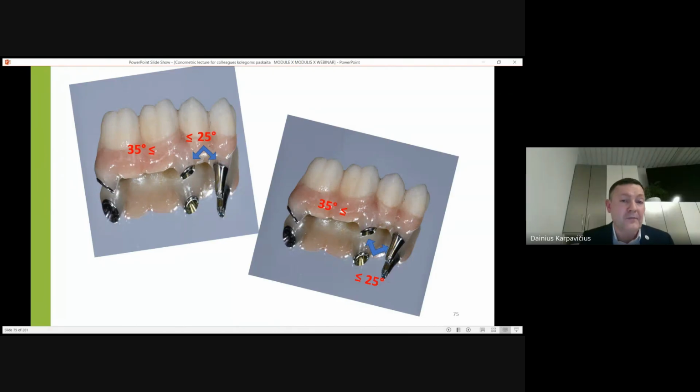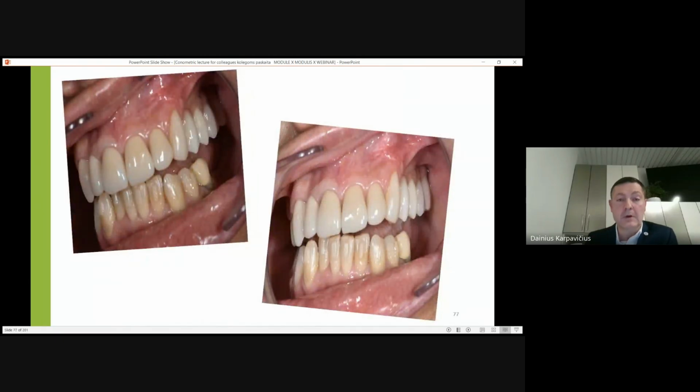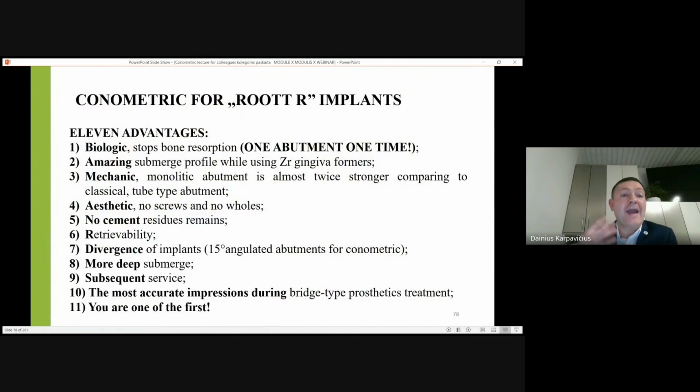I am a specialist implantologist doing surgery and prosthetics, and knowing drawings and all the features of accessories, it is easier for me to share these numbers with you, dear colleagues. These numbers give you more possibilities to understand everything. And now a simple bridge comes into the mouth without any sinus lift or additional augmentative procedures.